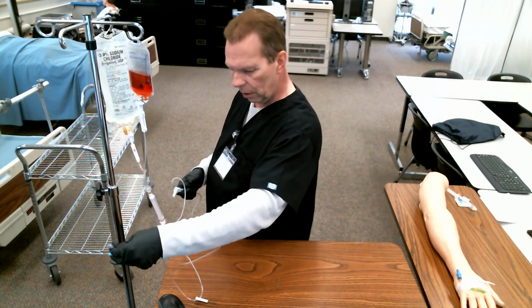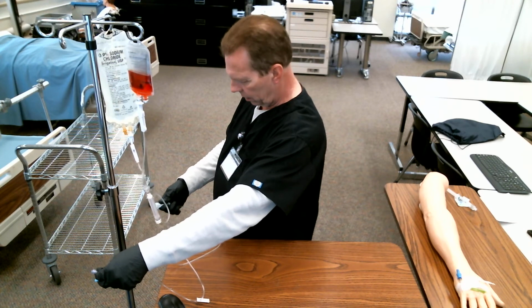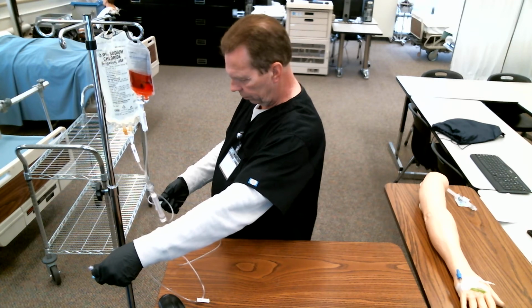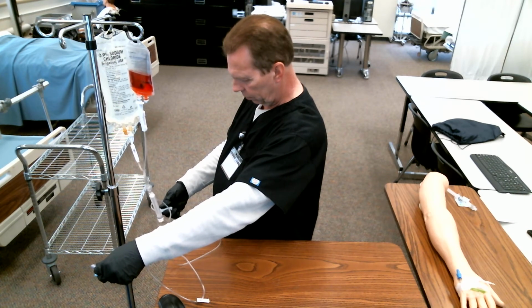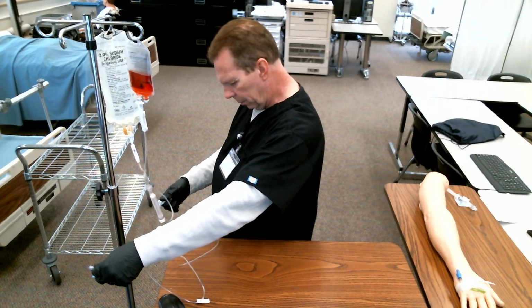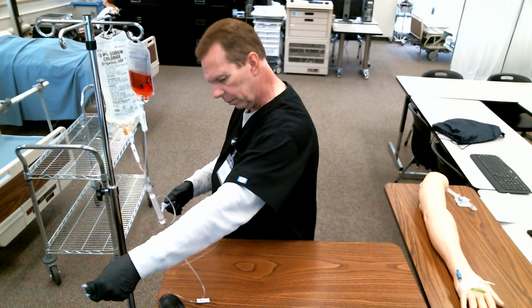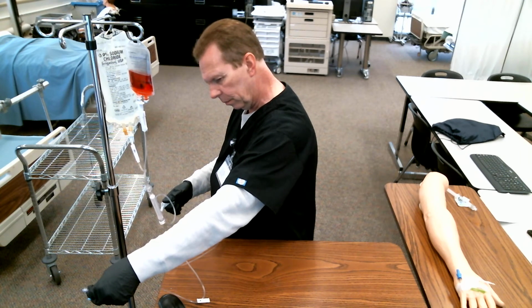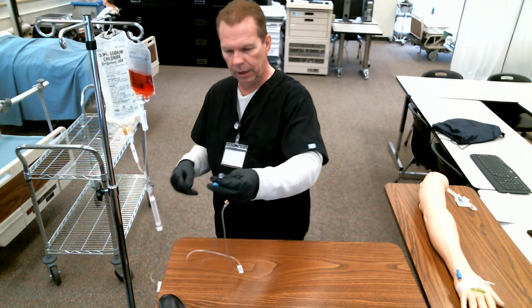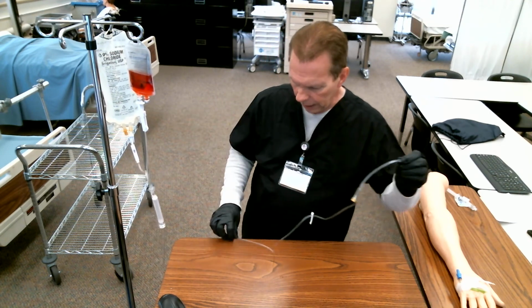And so then I'm just going to open my regulator and start priming my line, and it's coming through. I'm just running it a little slow. All right, and so I've got some coming out at the end. All right, so I've purged my line and got that done.